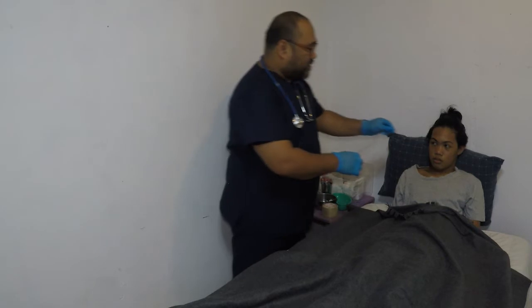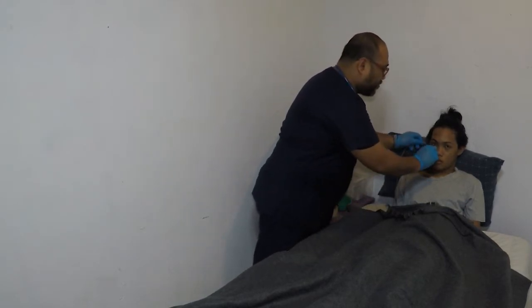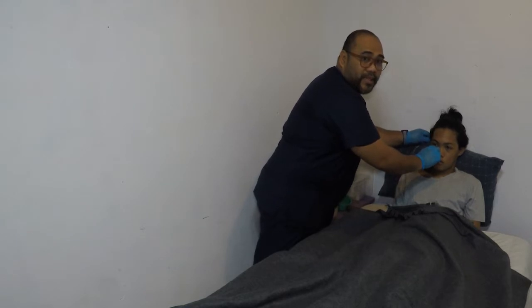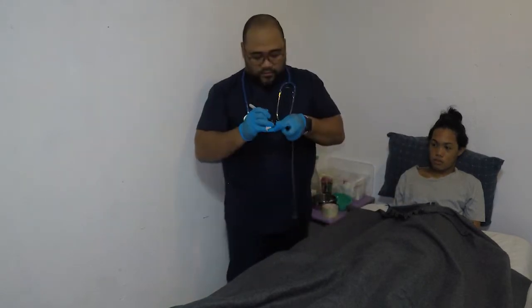Okay? Measure the distance to insert the tube by placing the tip of the tube at the client's nostril and then extending to the tip of the earlobe. And mark the tube with a marker pen or piece of tape. Okay, measurement ensures that the tube will be long enough to enter the client's stomach.